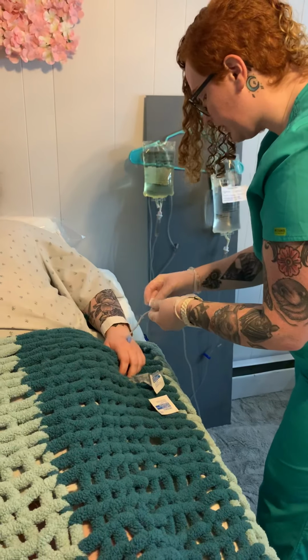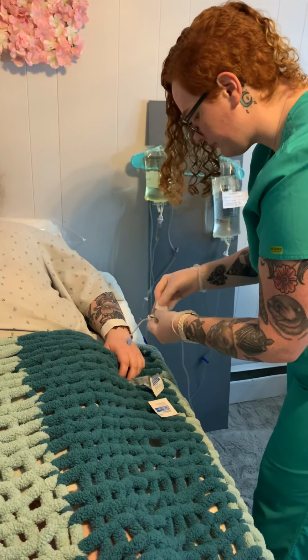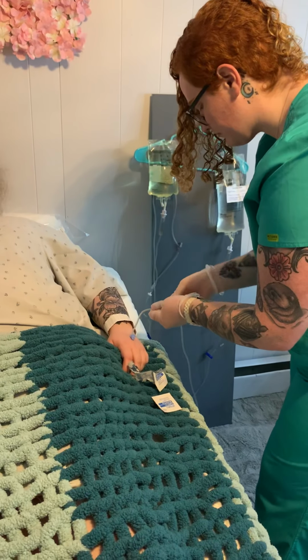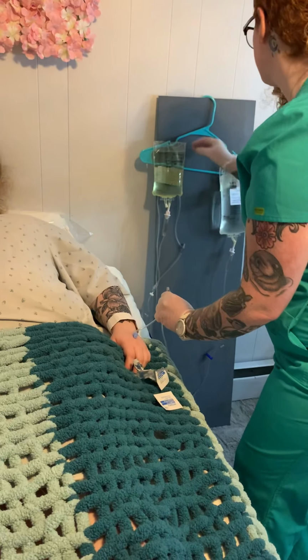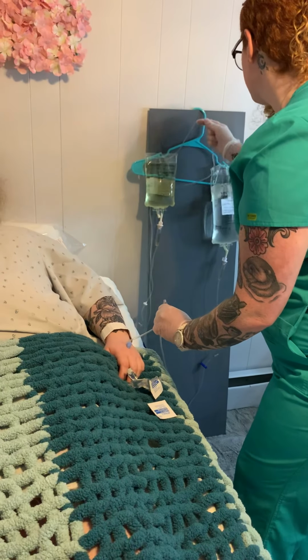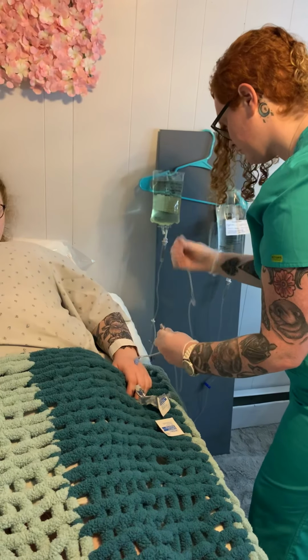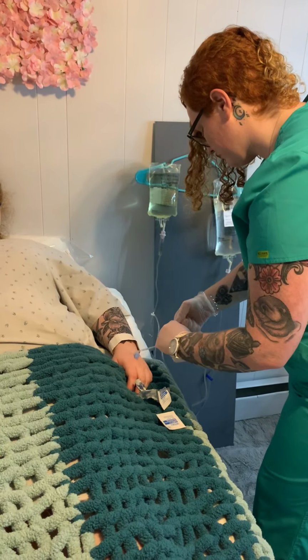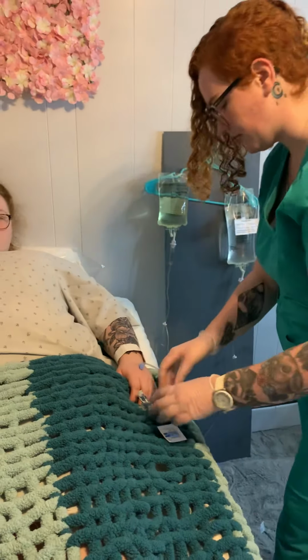Alcohol again, and we can connect our flush bag tubing to this lower port. And we will turn on the 30 mLs per hour.